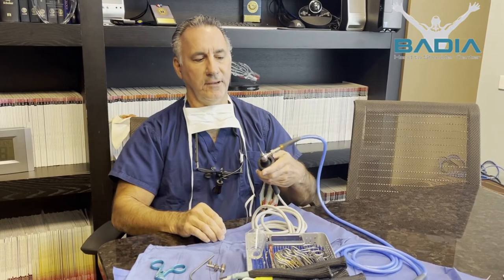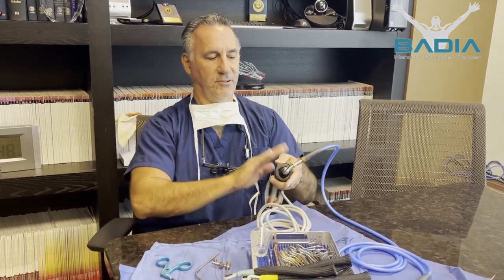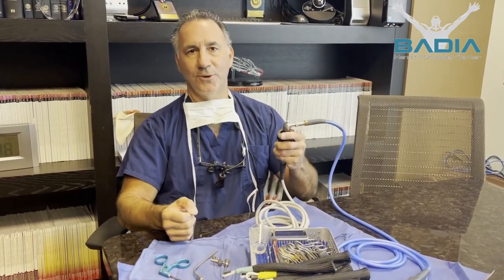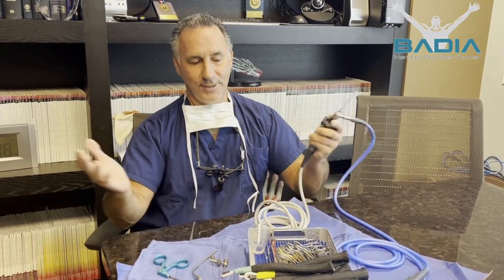We also use radio frequency, which is a technology that takes the collagen and basically creates a tightening of the tissue. There are a number of different things we can do. All of these surgeries — in my case whether it be the base of the thumb, the knuckles, the wrist, the elbow, and the shoulder — can be done with just two or three little holes. That's arthroscopy.